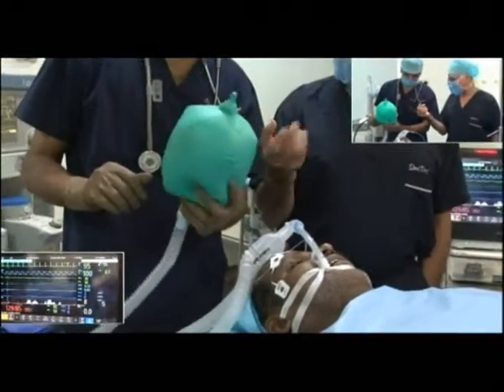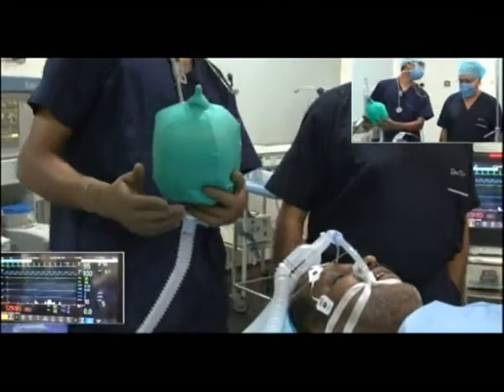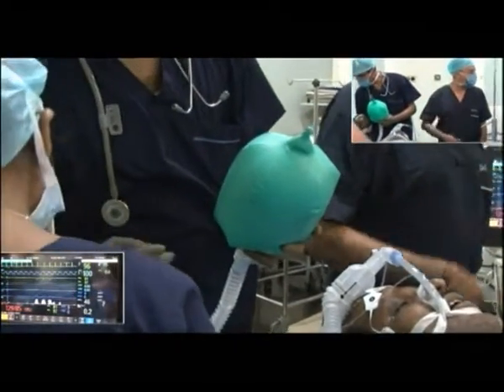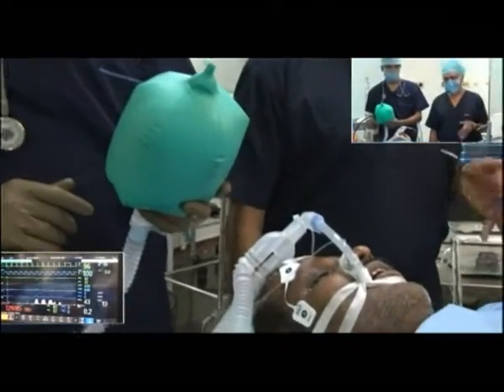Yeah. So don't forget, just keep ventilating gently. He's opening his eyes. Yeah, but he's weak. So desflurane is off.